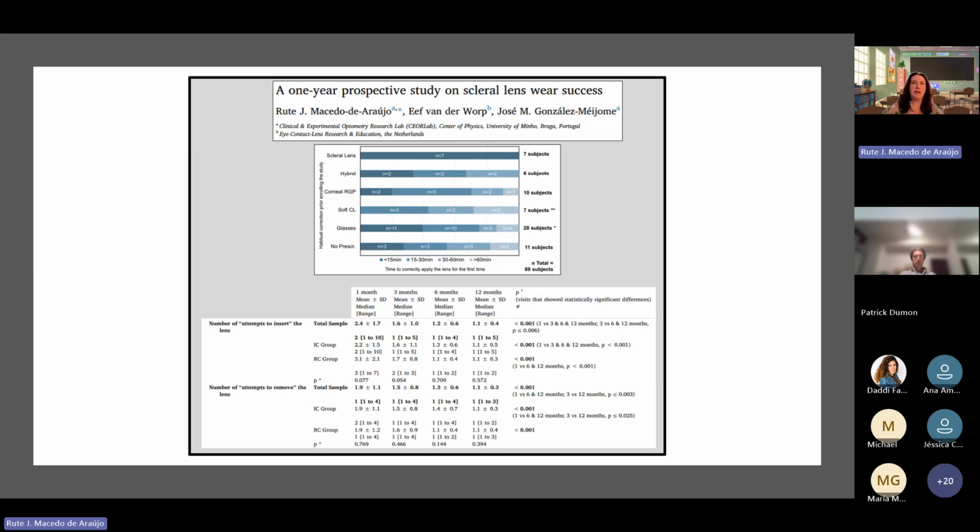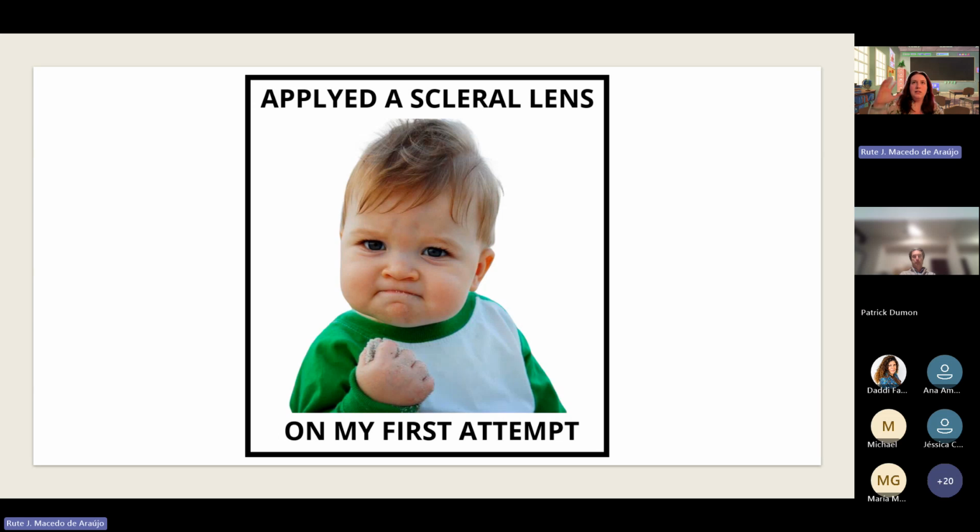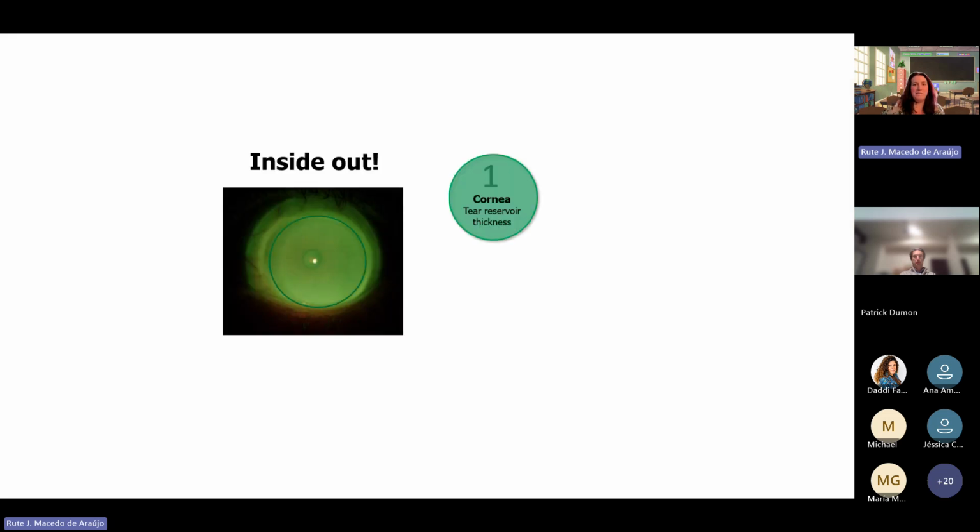And even when the lenses were dispensed, we can see here the number of attempts to insert the lens that they reported at home. So in the first month, we can see that many of them could need 2 or more attempts to insert the lens correctly for the first time, but it will decrease over time. So most of them will put the scleral lens on the first attempt after 3 months. So this is a feeling when we apply the lens for the first time with the first attempt. Now let's move to the evaluation of the fitting. This is an inside-out approach.